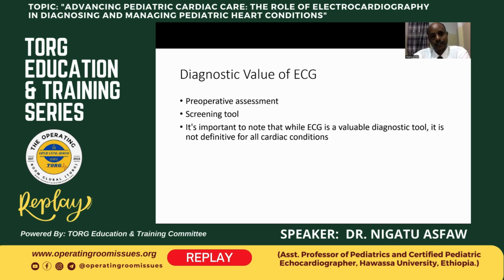And if there is risk, particularly if a patient has some cardiac abnormalities, we need to perform ECG. If time permits or the condition is not an emergency, that may need correction of the ECG abnormality based on the underlying cause before surgery. And ECG can help us also as a screening tool.